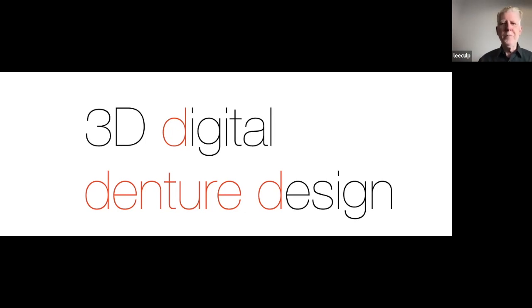So as an example, if you're using CareStream, iTero, whatever, the only color file that I can bring in my system and actually see the color of the teeth and the tissue and everything is Trios. So it will allow me to bring in iTero, but it will not allow me to bring in the iTero PLY file, which is the colorized file. So that's the problem. Can we bring it in? Probably. Is 3Shape going to let the PLY file in? Not yet.